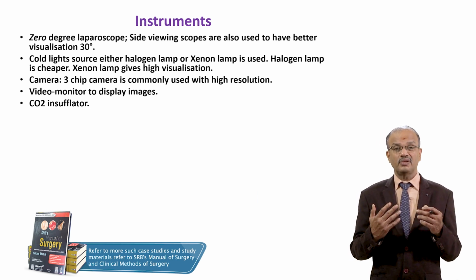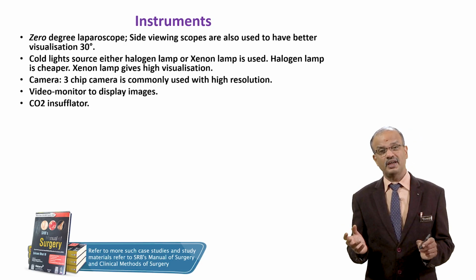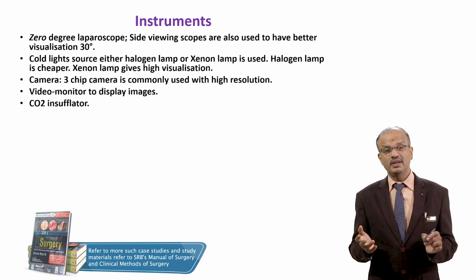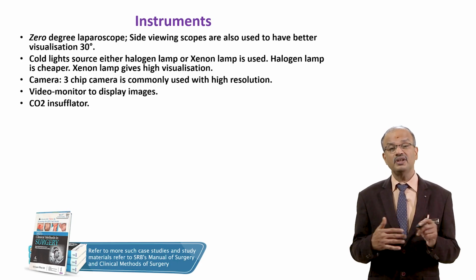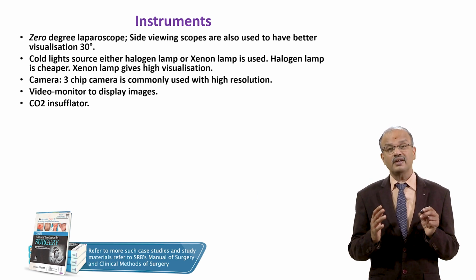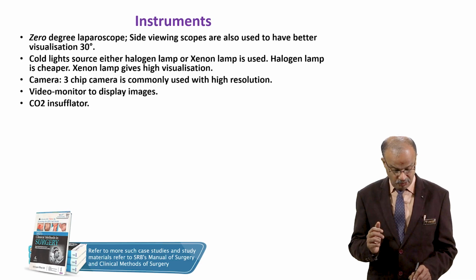So what is called a pneumoperitoneum, and carbon dioxide is used for that. So you should have a carbon dioxide insufflator for that. How much carbon dioxide, how much pressure, how much flow rate, totally how much, everything is assessed, because carbon dioxide is inert and non-inflammable. Oxygen, nitrous oxide, all these can be used, but they are inflammable. It's very dangerous. You can't use cautery, you can't use an energy source. That's why the ideal and cheaper gas to create pneumoperitoneum is carbon dioxide. So the gas used for pneumoperitoneum in laparoscopy is carbon dioxide. It's very clear. You should not have any confusion about that.